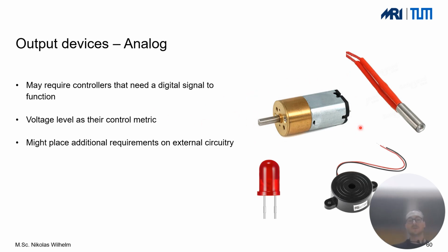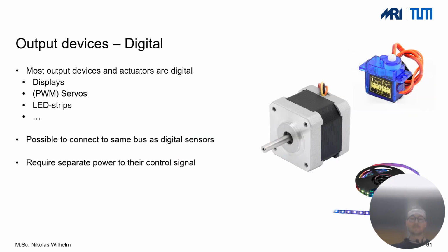And there are solutions that are a bit simpler to use, as we're going to see in a second. So all of these systems often will require you to use additional external circuitry.